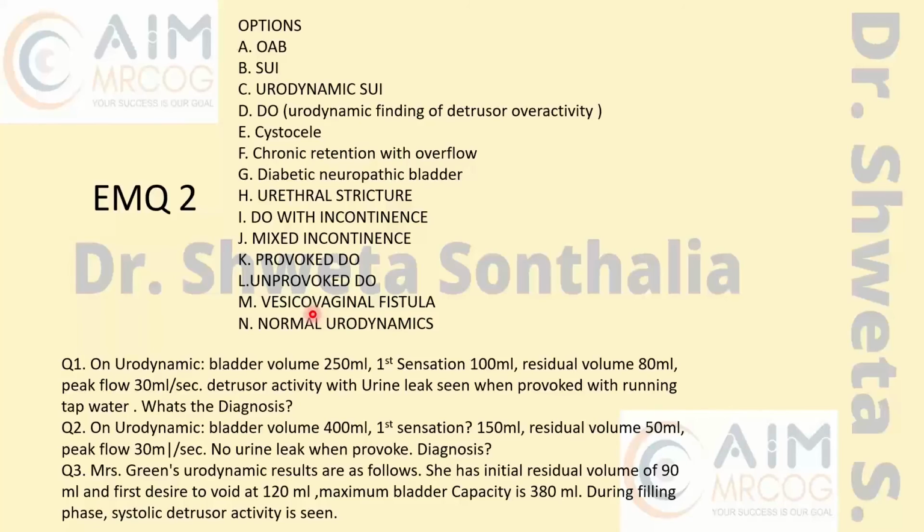Very good, normal urodynamics. Diagnosing normal is a big thing, believe me, because you are constantly thinking about abnormality. So if you see normal, if you really are confident, then only in the exam will you choose normal. Otherwise, you will keep finding the problems. So diagnosing it as normal is a really commendable job. I'm very happy that you could understand it is normal. Very nice. So normal is right. Next question.